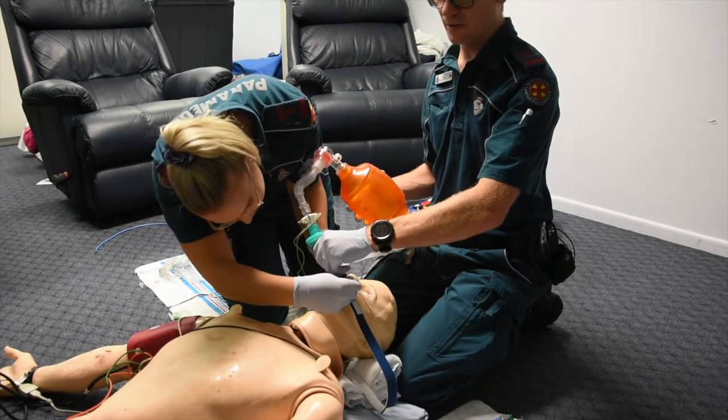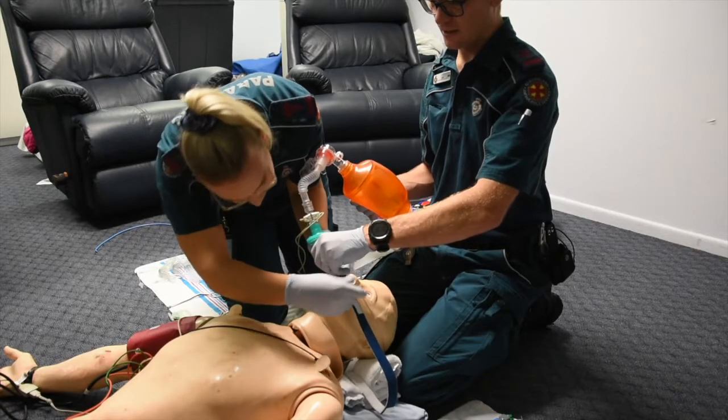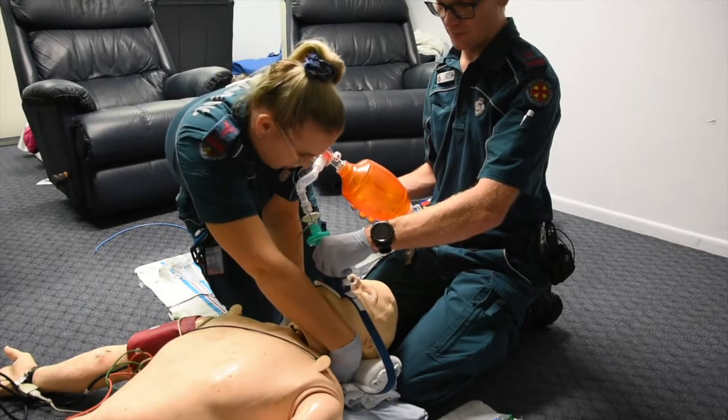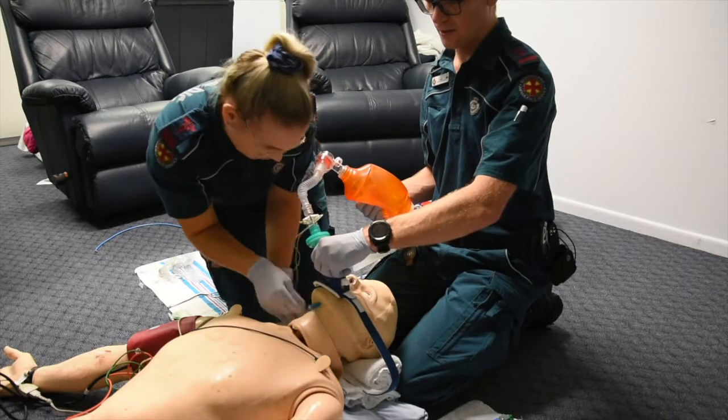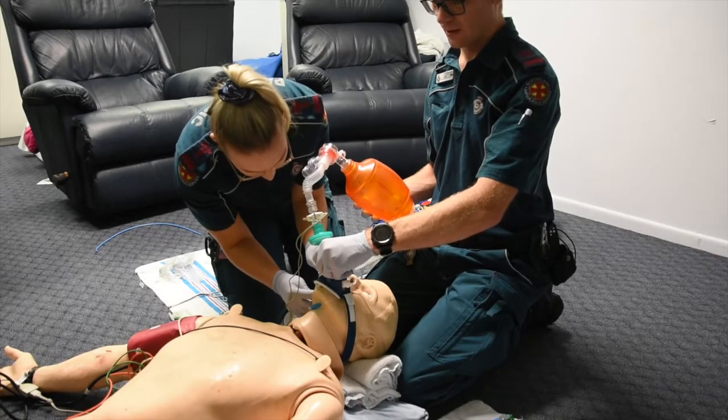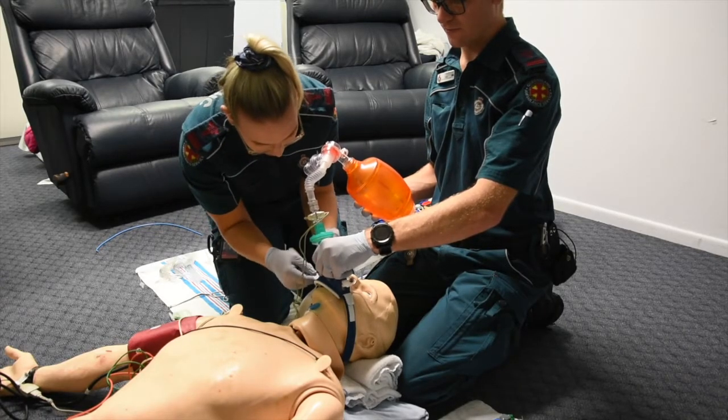So this is obviously something you need to think about post-intubation, is how we're going to secure the tube. Lucky with the Thomas tie here, it's got a bite block in it, so we don't have to worry about putting an OP or anything in there. So we've had a first pass success, first attempt.